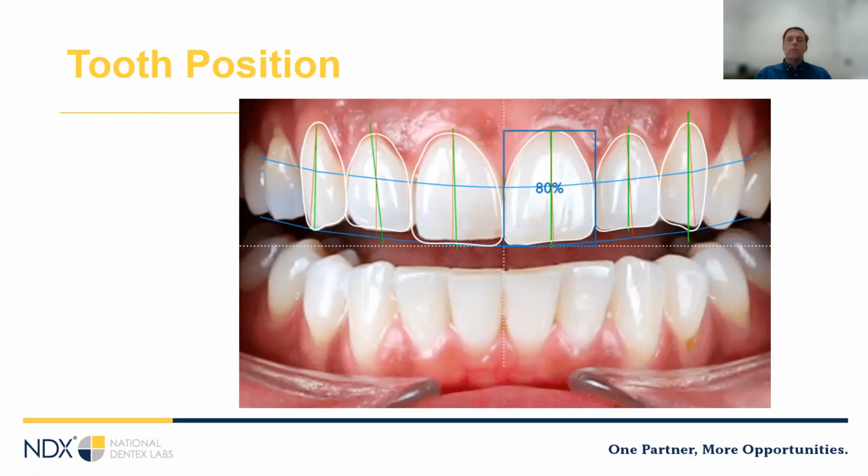There's a few other rules of anterior tooth position that can be helpful. First is centrals flat to the front.